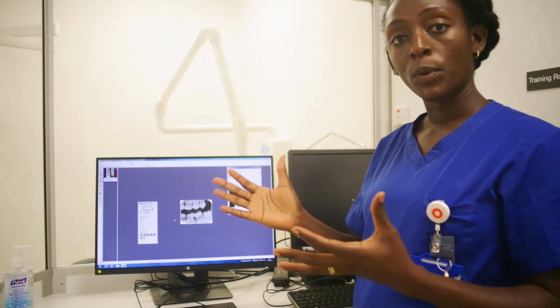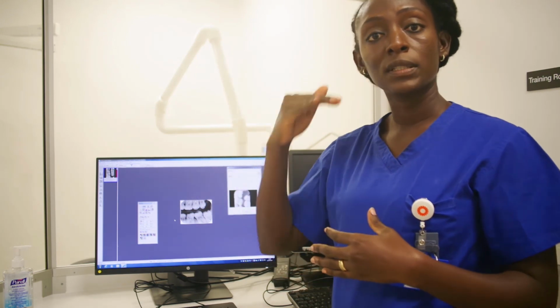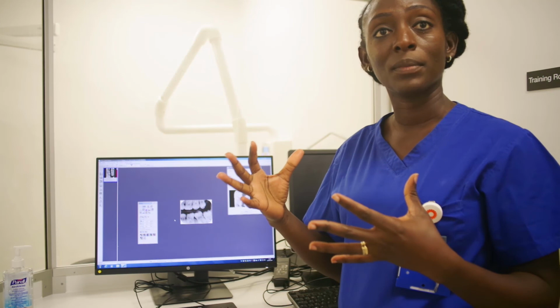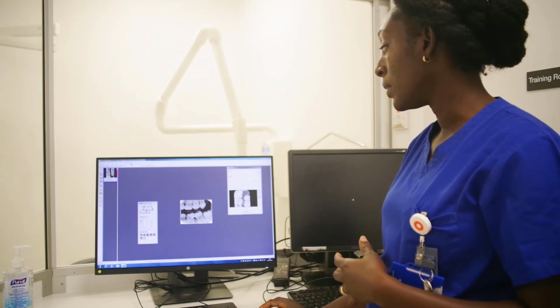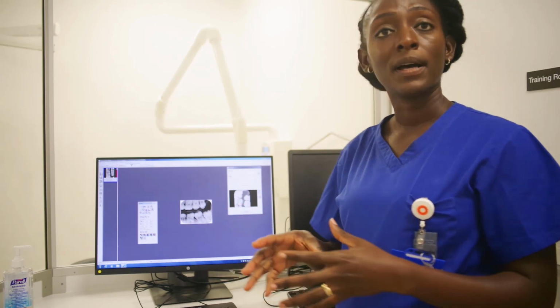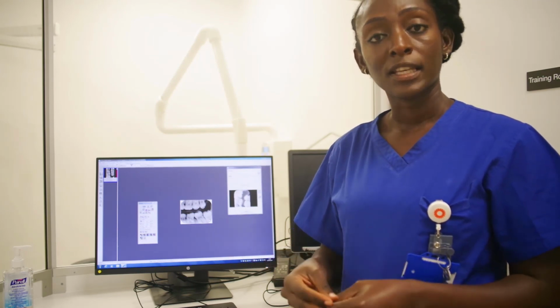In terms of exposure, what you'd want to ideally see is the different tissue structures, so enamel, dentin and pulp. Are you able to visualize them appropriately? So in this radiograph, you can actually see enamel, dentin and pulp nicely there. You can see the trabecular pattern, everything is in focus. So it shows that you selected the right exposure.